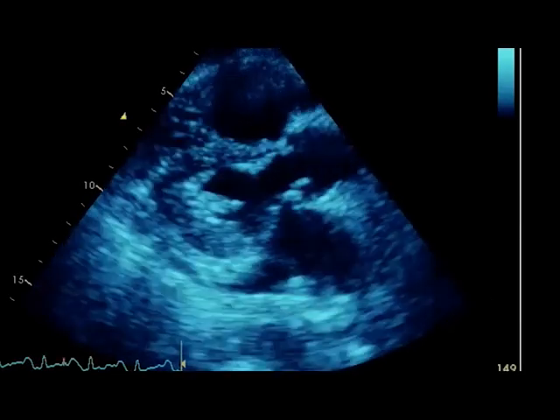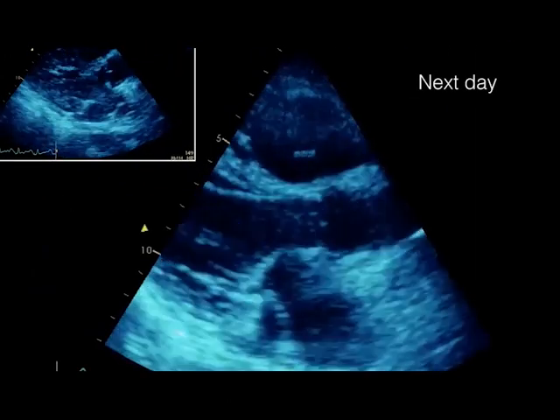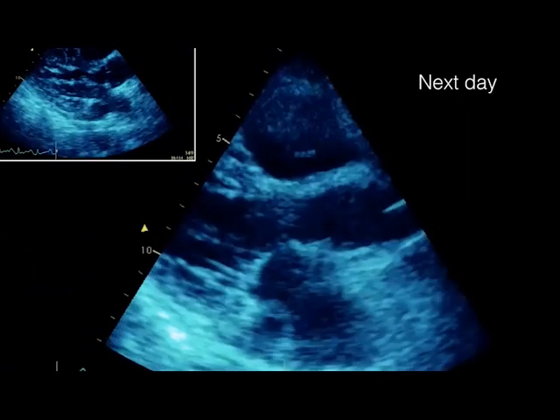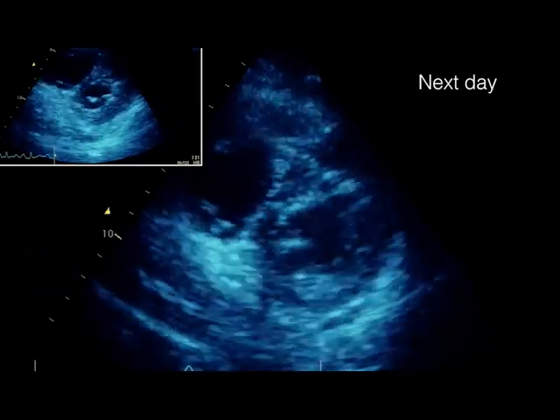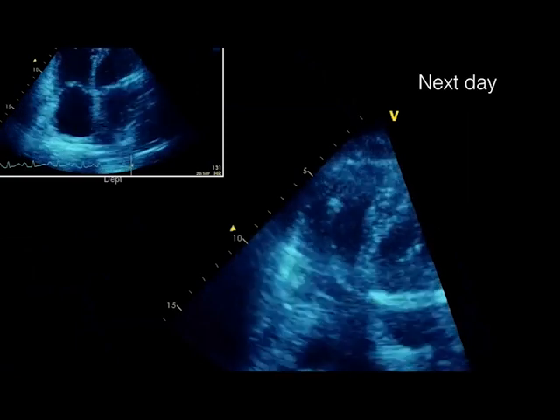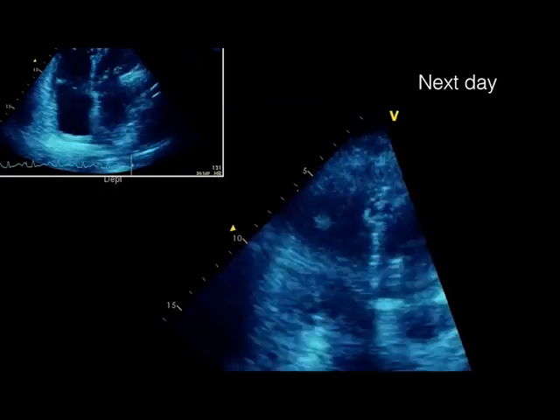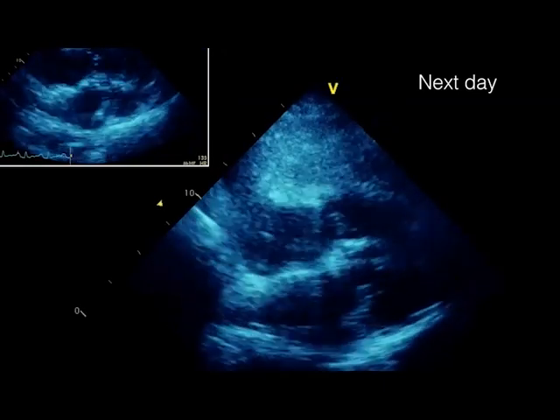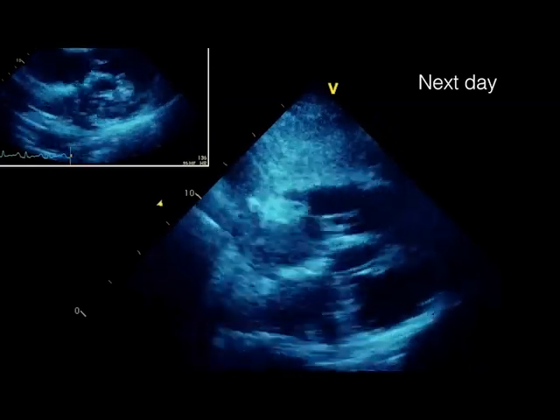Here's what happened. The next day her heart rate was much better, the left ventricle was smaller, and there was much less D-shaping of the septum. In short axis, the right ventricle that was twice the size of the left ventricle is now probably closer to the same size — particularly looking at the mid and apical levels. That is a much happier, better-moving ventricle, and we saw that across all other parameters. Subcostally, the RV looks much happier in size and function compared to the left ventricle.